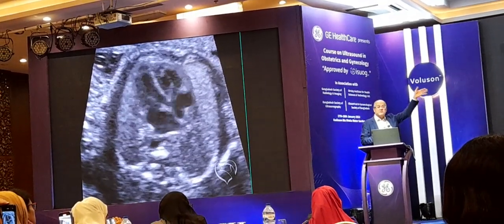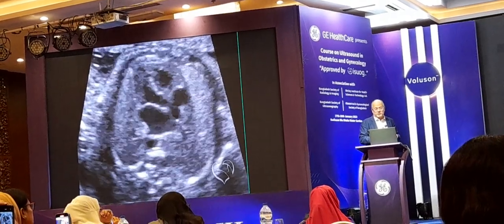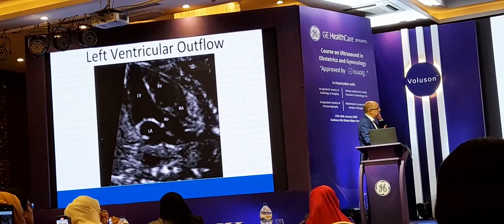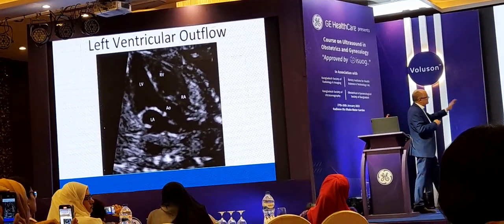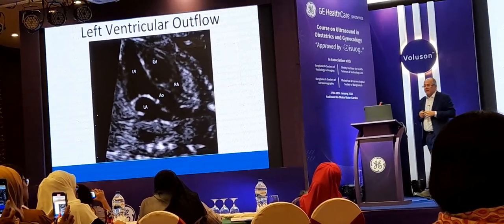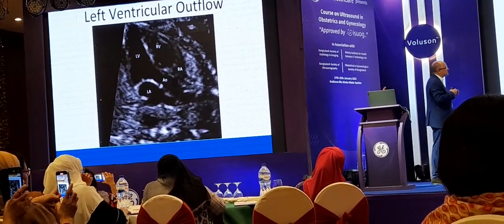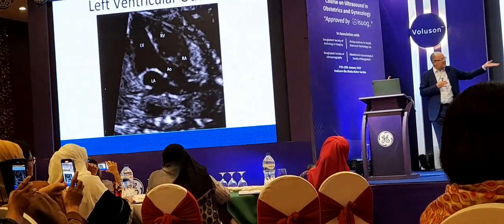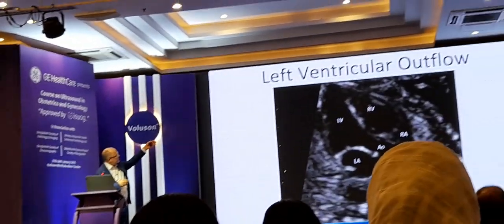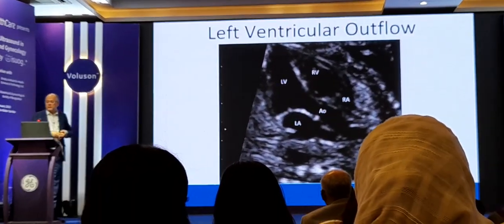of the baby. The first thing that comes out is the aorta. The aorta comes out from the middle of the chest, of the heart of the baby. So there's the left ventricle, aorta leading there, right atrium, right ventricle, a beautiful and normal left ventricular outflow tract. And we're going to look at a number of things on this. The first thing we're going to notice is that there's continuity between the mitral valve, the interventricular septum, and the aorta.